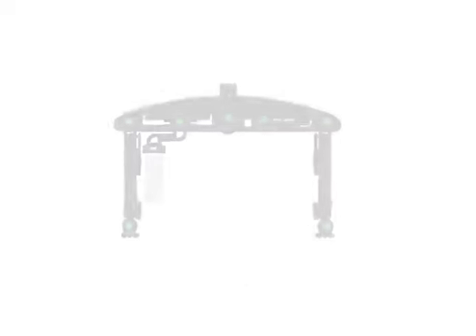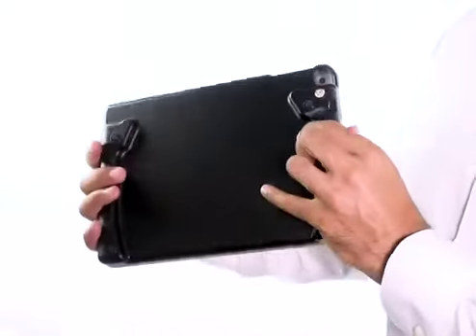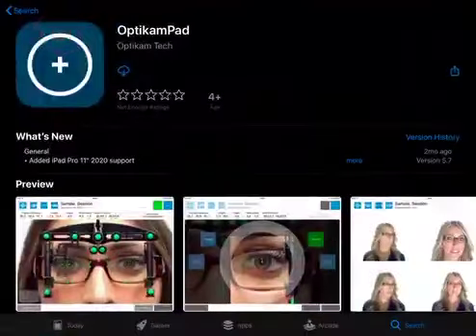Your measurement kit includes the Optikam Posture Device and a flash enclosure for non-iPad Pro tablets. The following steps get you started. Download the app from the App Store.